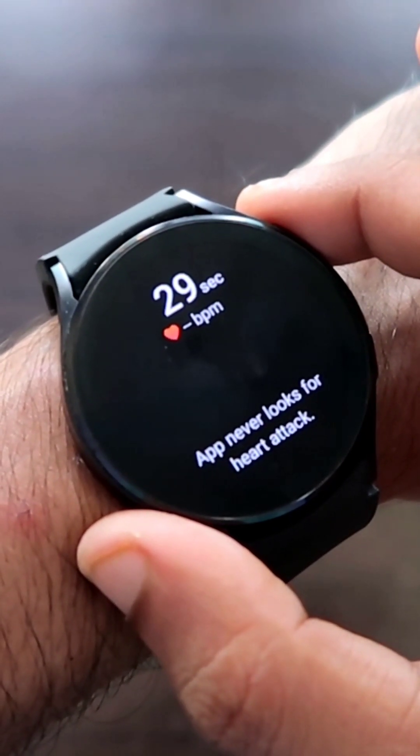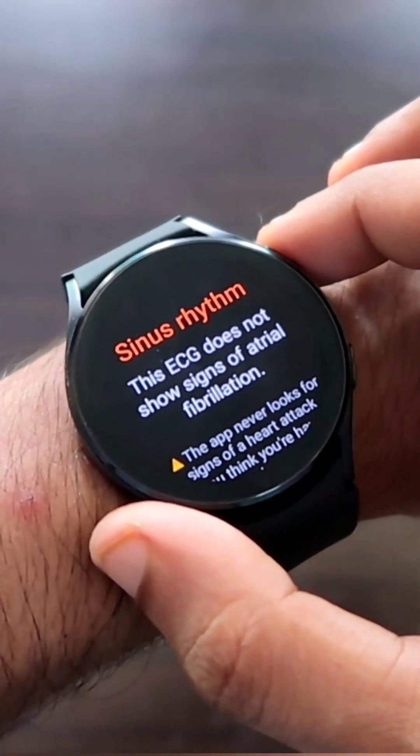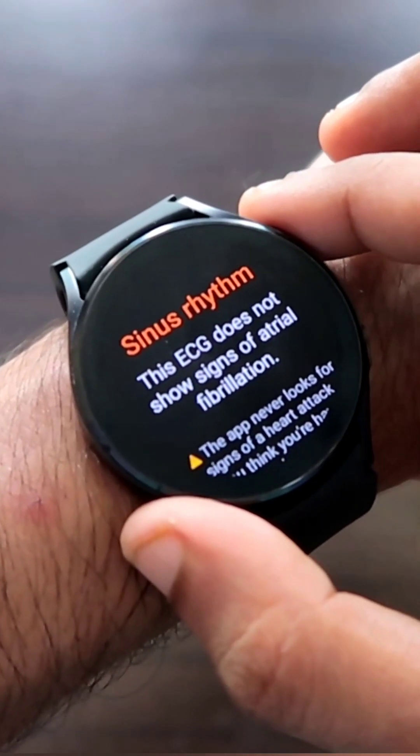Now the ECG will be calculated via the watch. It took 30 seconds to calculate my ECG, and here it is giving me the reading of my ECG, which is sinus rhythm — which means that everything is OK.